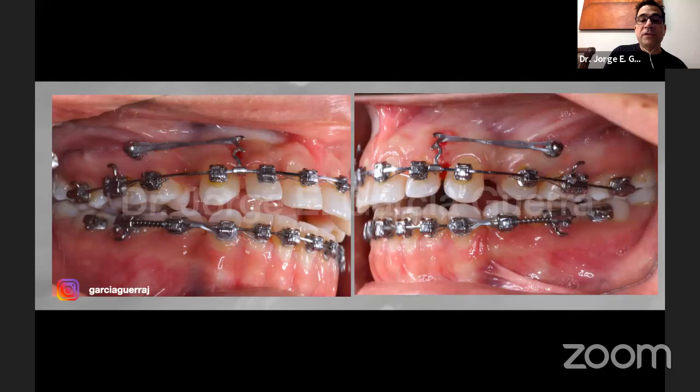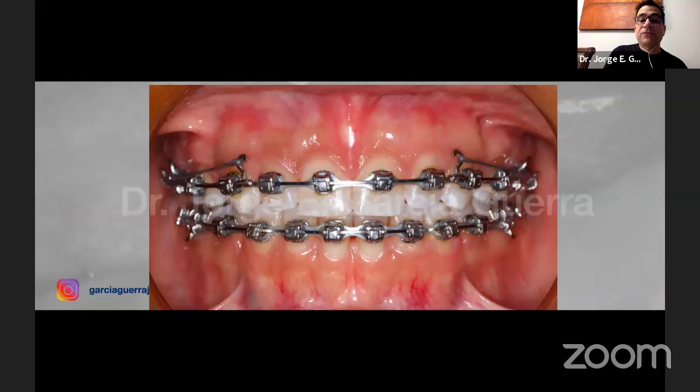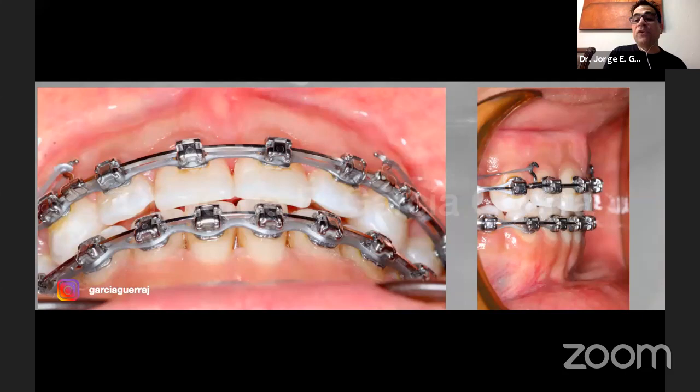Don't get worried, you're gonna see at the end, it closes all. And this is a few months later. Now we've closed the spaces and we have a correct overbite and overjet there. Now, if you look at the incisor position, we on purpose created that open bite and protrusion. So when we close the space, it finished in the correct position.